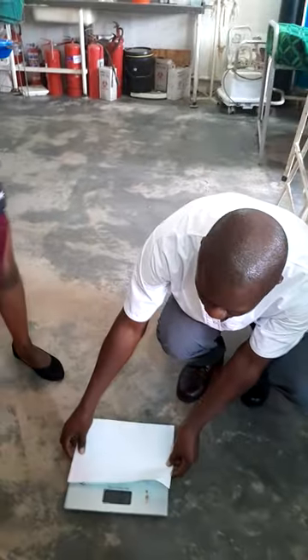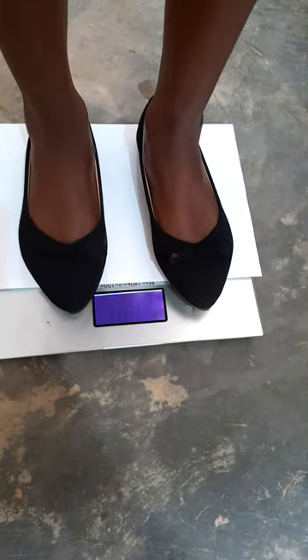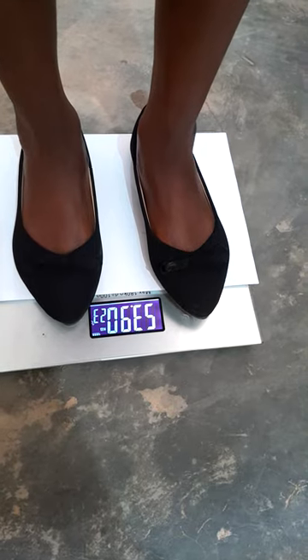This scale is digital, so it will turn on as soon as the patient steps on it. Go ahead and step on it. It's giving us the weight in kilograms. Let's look at her posture — this is how you're supposed to stand. The patient should not be fidgeting or looking down or sideways. She's supposed to stand like that so that you get a correct weight.